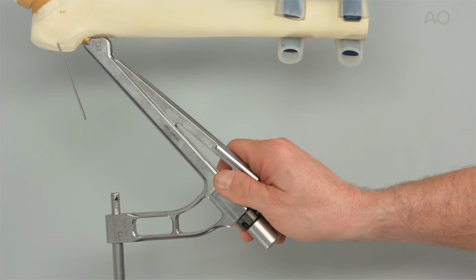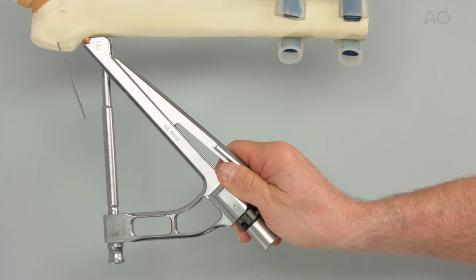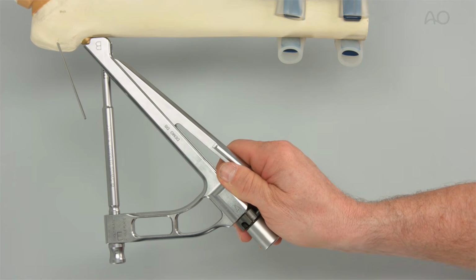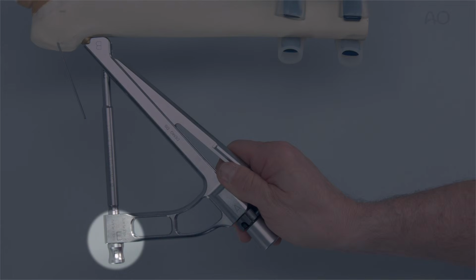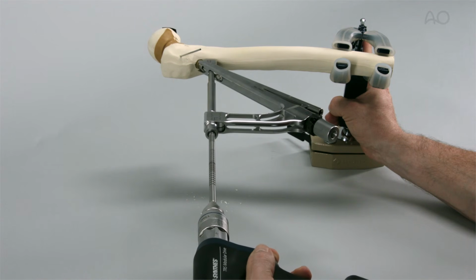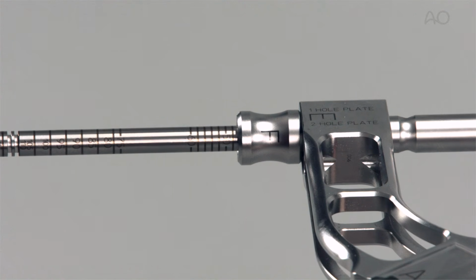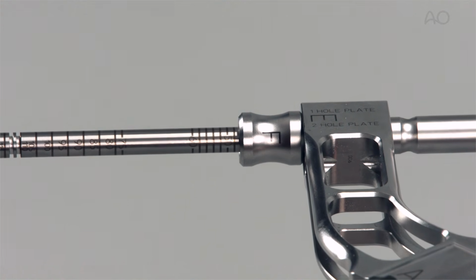The protection sleeve for the locking screw is inserted into the most proximal hole of the insertion handle. Observe that the protection sleeve is in full contact with the handle when completely inserted. The 4.3 mm drill bit is inserted into the protection sleeve, and the bicortical screw hole is drilled, and the screw length is read directly off the drill bit.